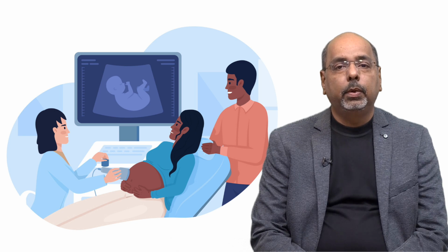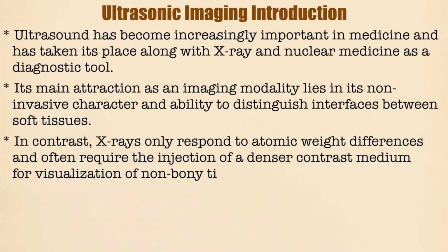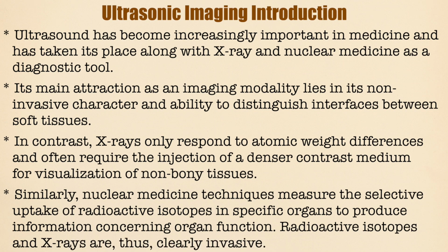Now we are going to see brief introduction of ultrasound imaging. Ultrasound has become increasingly important in medicine and has taken its place along with X-rays and nuclear medicine as a diagnostic tool.